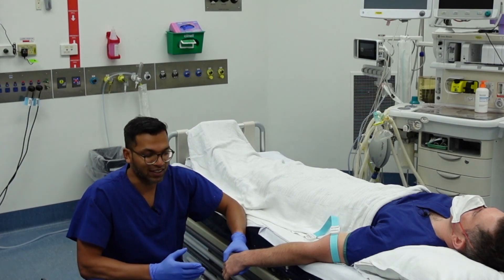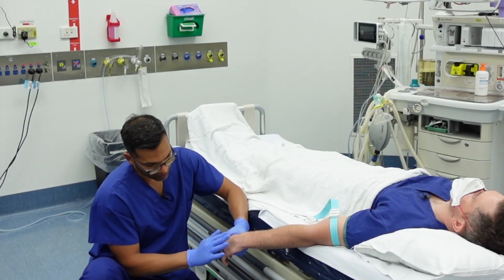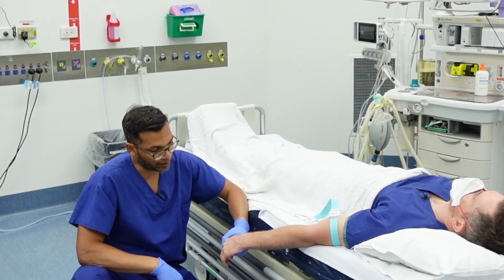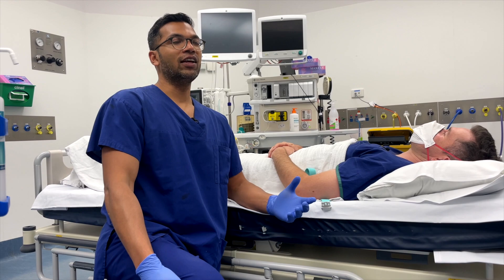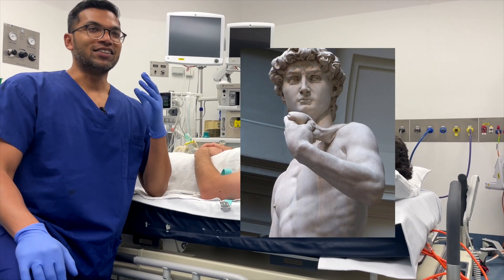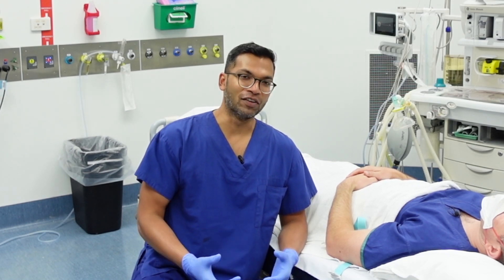My colleague here has particularly good veins. Another thing you can do is tap the veins — that increases the vasodilatory mediators in that vessel and allows the vein to pop up even more. Some patients feel discomfort from this, in which case I just rub, but a few gentle taps are usually well tolerated. Interesting fact: in the Statue of David, one arm is down and one arm is up. The arm that's down has veins that are prominent and visible, but the arm up near the face doesn't — showing how observant the sculptor was about the hydrostatic pressure gradient.